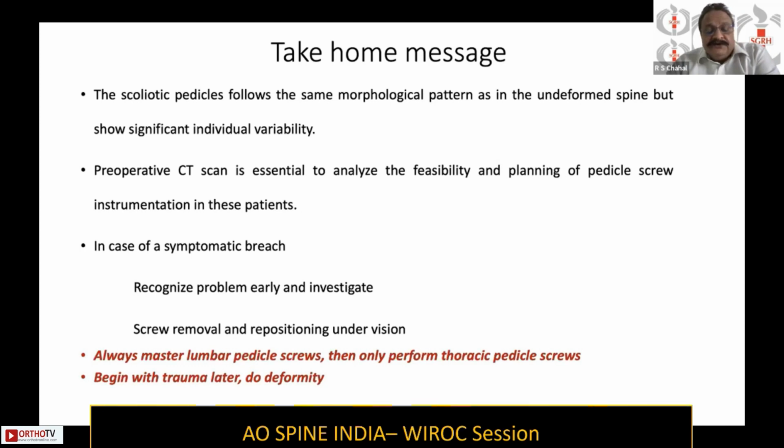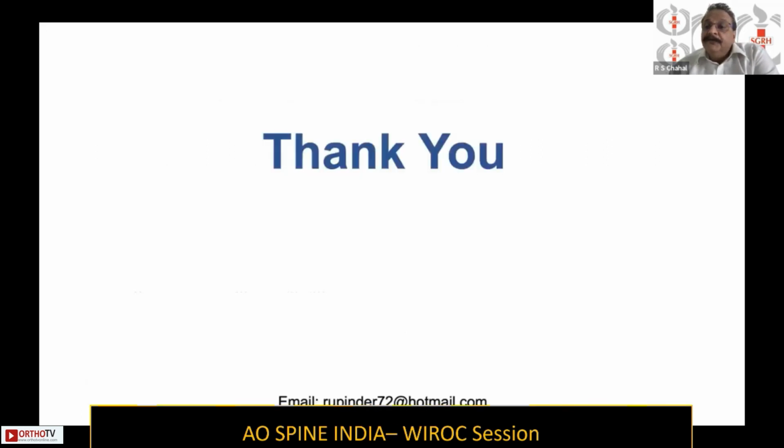Screw removal and repositioning should always be under vision. Always master lumbar pedicle screws, then perform thoracic pedicle screws. Begin with trauma and later do deformity.